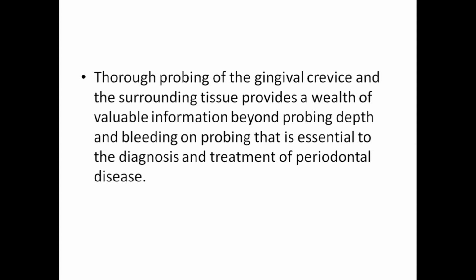Thorough probing of the gingival crevice and the surrounding tissue provides a wealth of valuable information beyond probing depth and bleeding on probing that is essential to the diagnosis and treatment of periodontal disease.